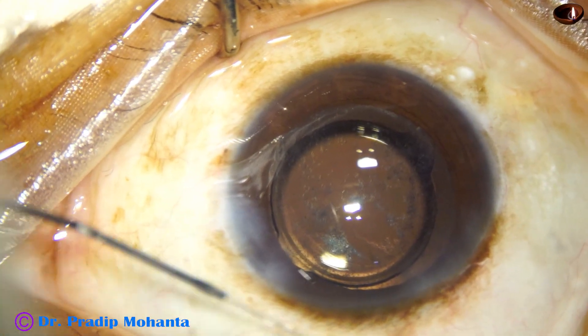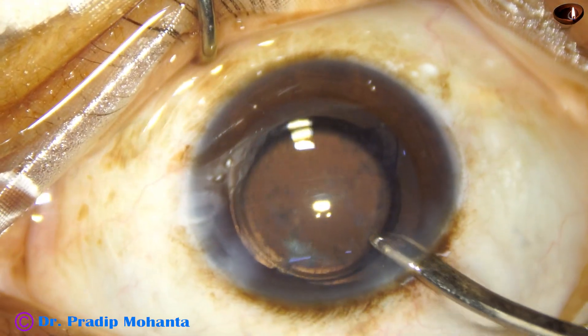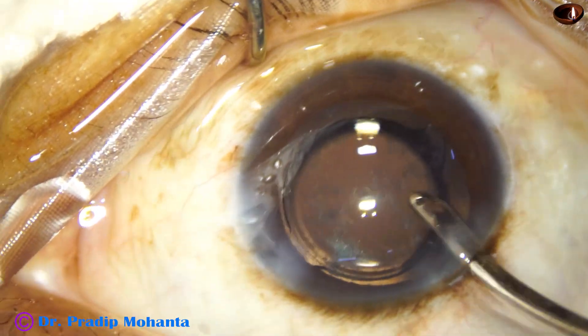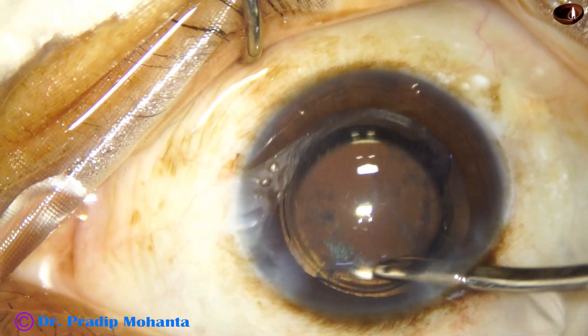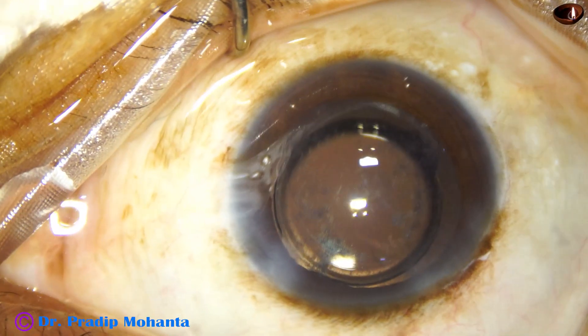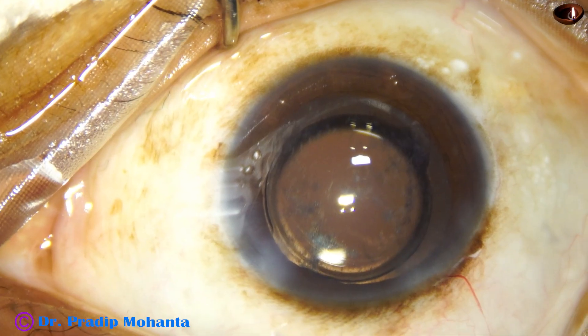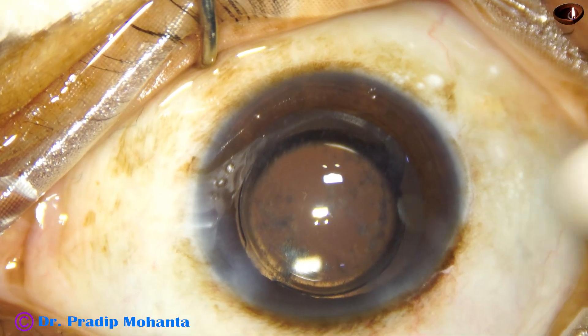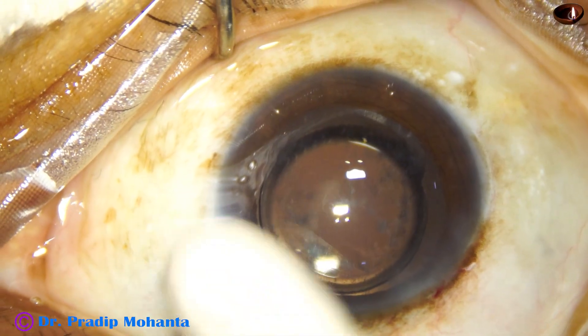The side port is closed by corneal stromal hydration. Most of the time my main wound is such that it will not require any hydration. What I do is come at the main wound with the Simcoe, fill up the chamber, and come out. I check with a cotton-tipped Johnson Bart if there is any leakage. No leakage is there. So here we conclude the case.